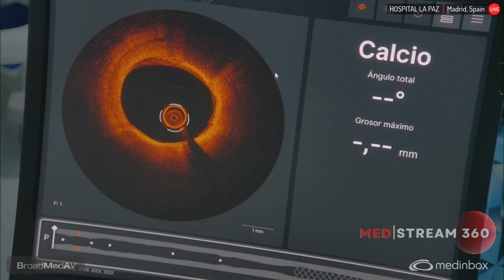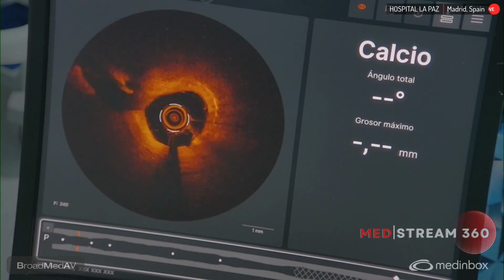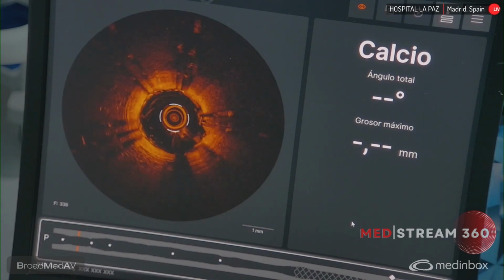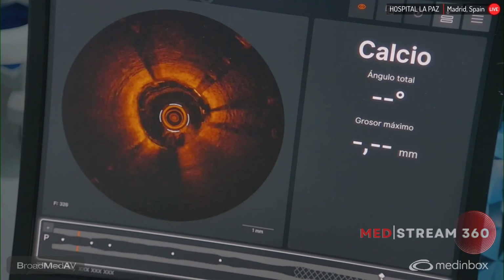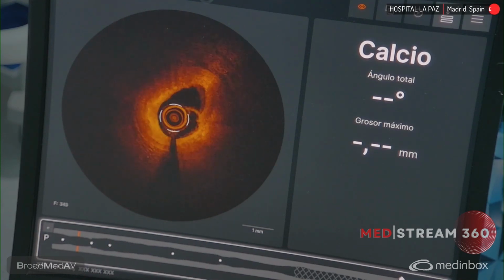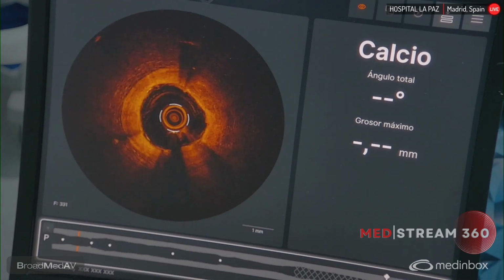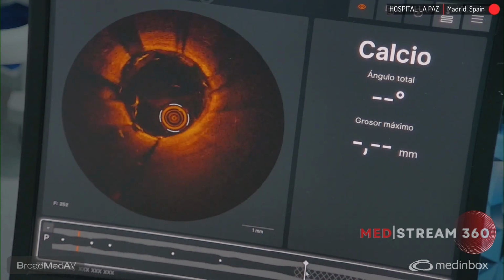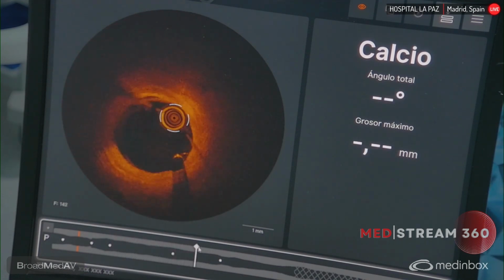The distal part of the stent is also okay. I show you the distal part we saw previously, and we have not touched there, but you can see here there is no dissection. In the angio there is a small plaque there, but I think maybe it has some spasm. I think okay, there is no dissection at this point. And in the proximal part, you can see the malapposition is practically corrected. So I think we do not have to treat the proximal part.